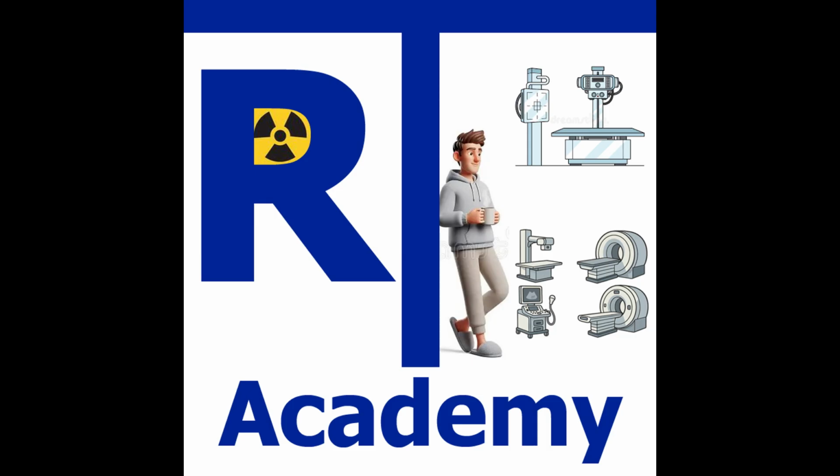So guys, our video ends here. As we mentioned at the beginning, this was just a basic overview. We only wanted to give you a glimpse of what components make up a radiology machine.